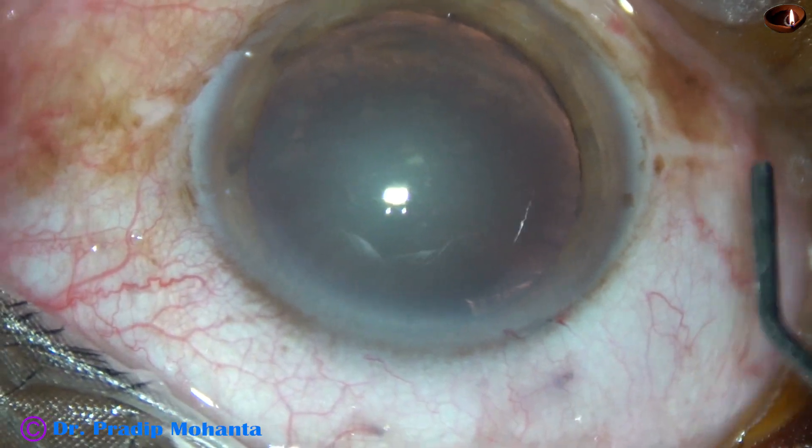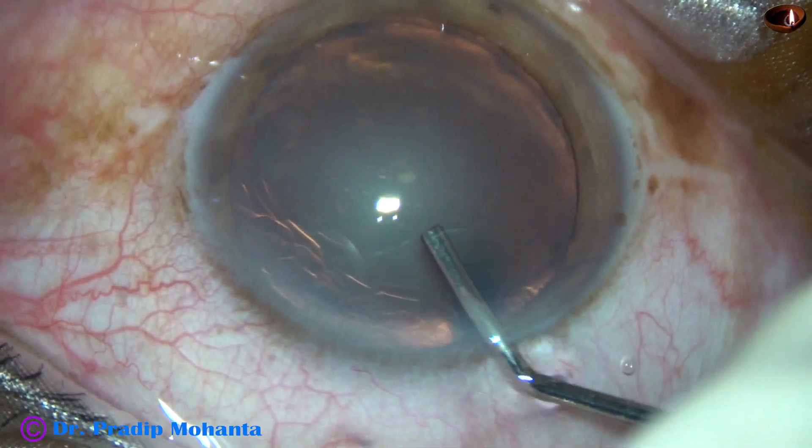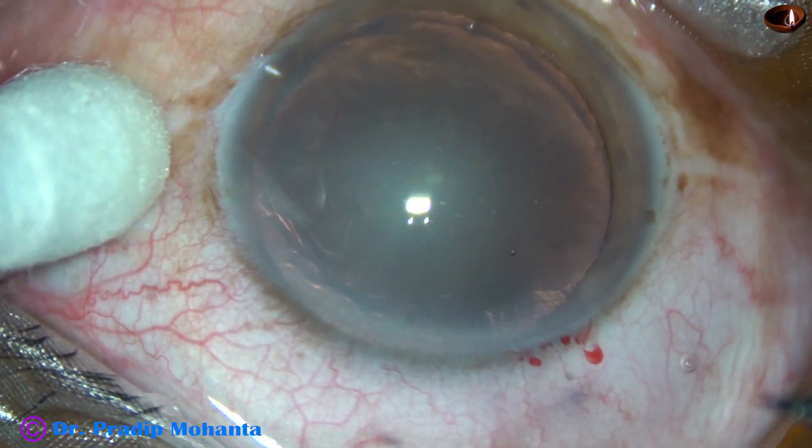We can see that the cataract is quite soft. The anterior chamber has been filled up with visco 2%. HPMC has been injected.